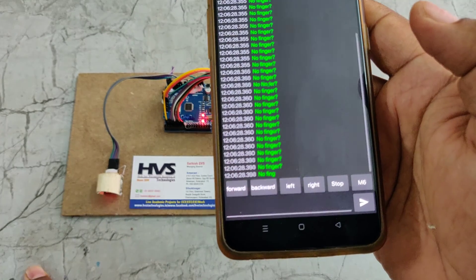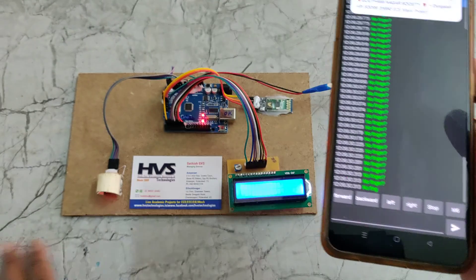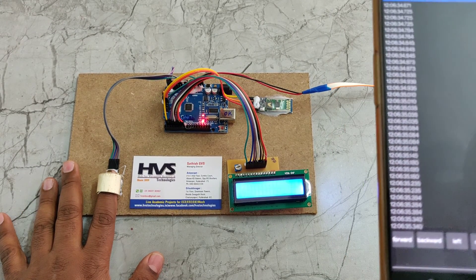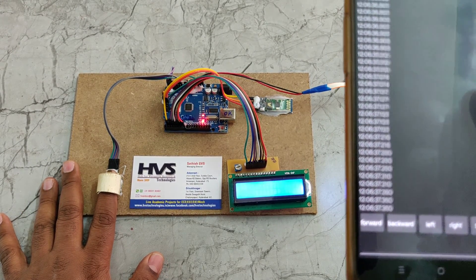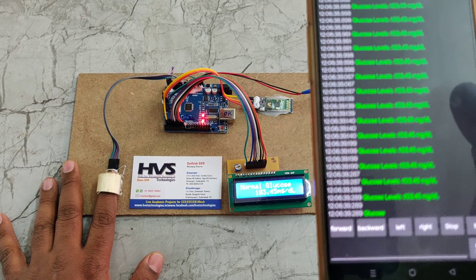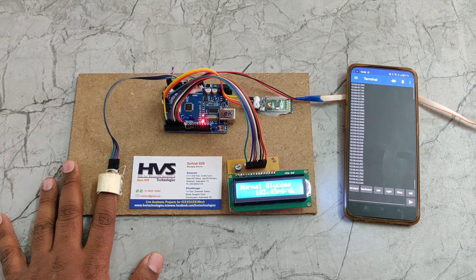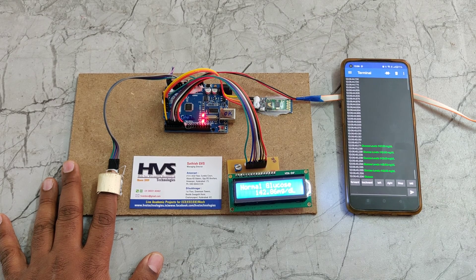It will then be connected. After connecting, if no finger is placed, no reading appears. Place your finger gently on the sensor — do not press it hard — and wait for some time. The glucose value will be calculated and displayed on the screen, along with streaming to the mobile phone application.